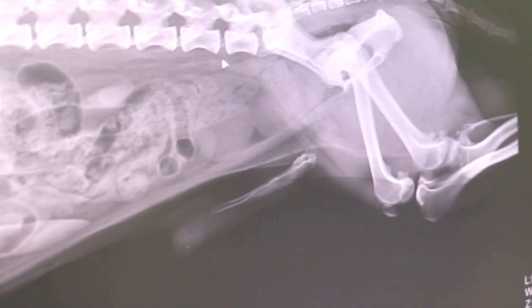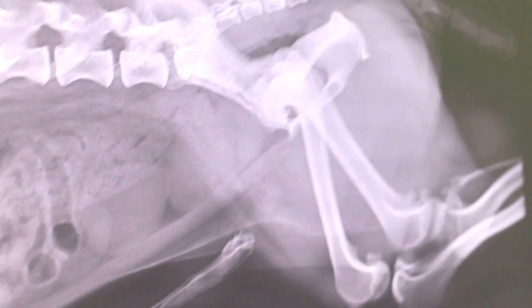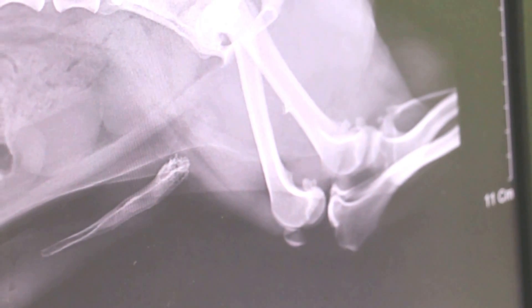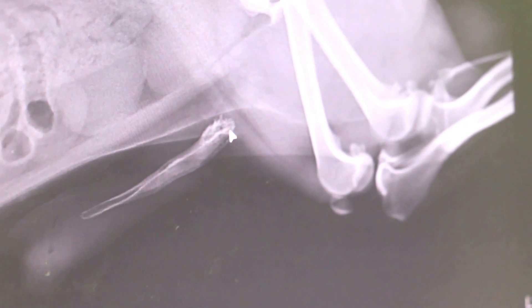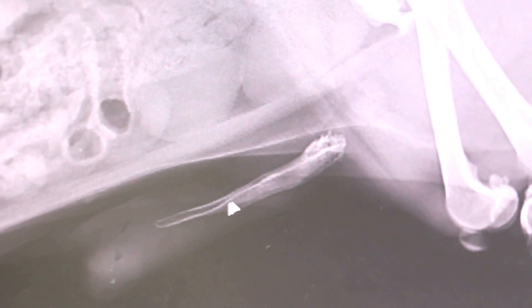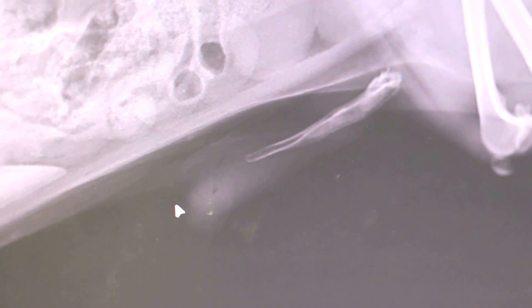The urethra is where the urine goes in. In the male dog, the urethra goes here and around the pelvic urethra, and then down to the os penis. The os penis is where the urine comes up — it comes up from here and then up to here. That is the passage of urine.